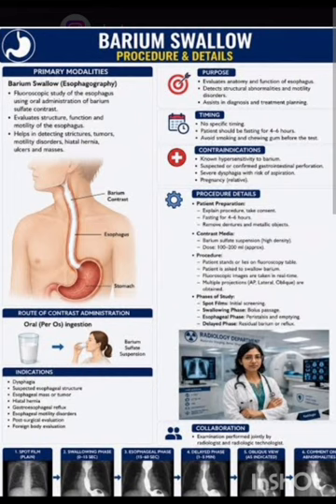After that, the patient is asked to take several mouthfuls of barium sulfate and swallow. During the swallowing, the radiologist observes the passage of barium under the fluoroscopy screen, and if necessary, spot films are taken in AP, RPO and LPO positions. All exposures should be made in suspended respiration. Again, several mouthfuls of barium sulfate are given to the patient and full-length films are taken through the spot film device. The films are taken from the pharynx to the cardiac orifice of the stomach before the esophagus empties.